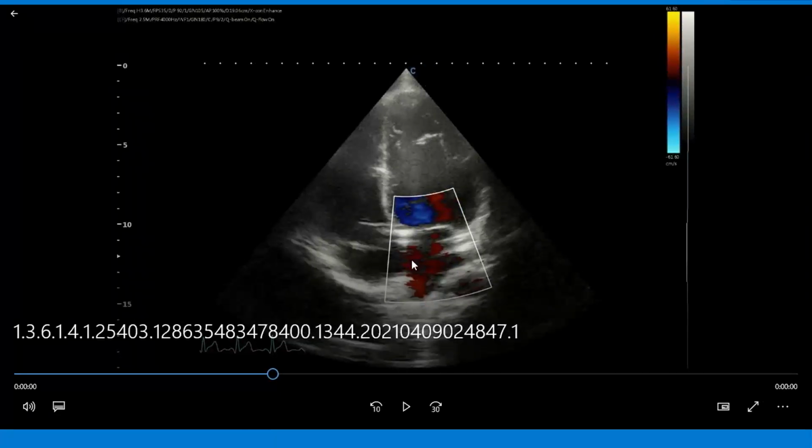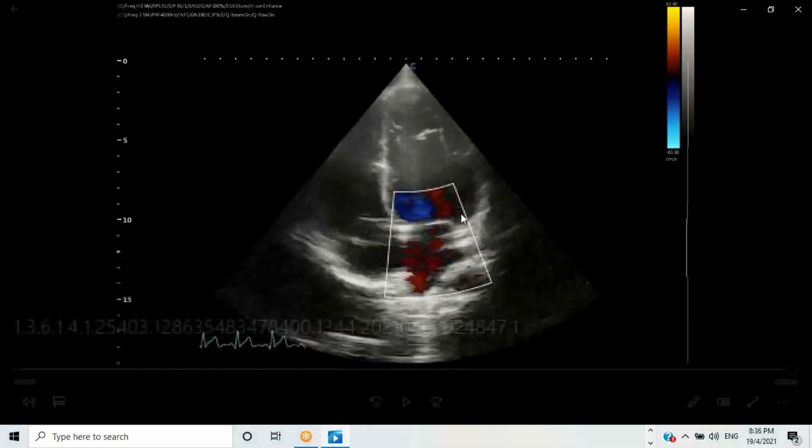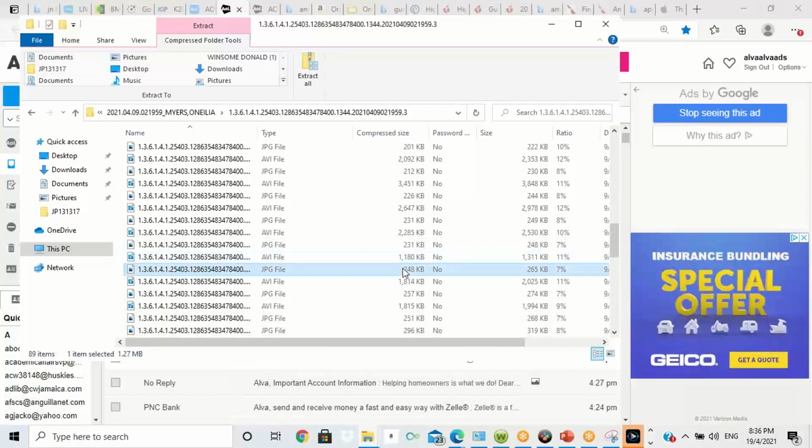So we'll put color across the mitral valve. Okay, so the color is across the mitral valve, and you're looking for regurgitation, of course. Regurgitation is a mosaic color. If the flow is moving away from the transducer, it's going to be varying shades of blue or a mixture.